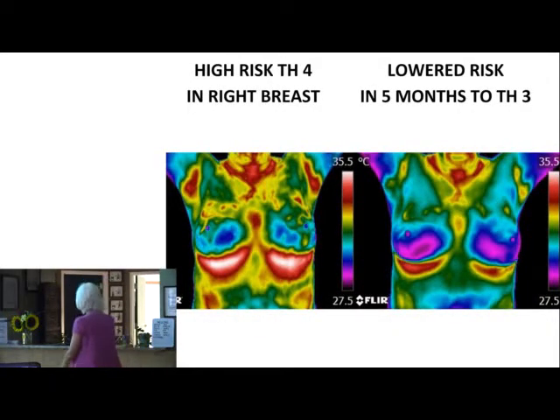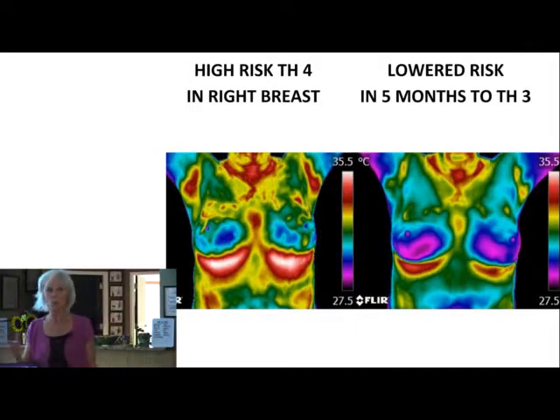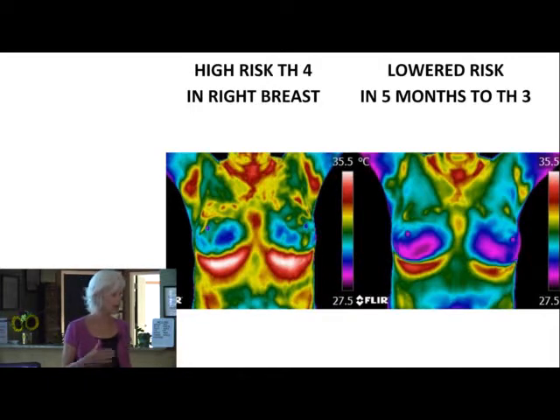Now we're going to start with some examples of before and after. If you give someone a risk assessment and you say that they are a 4 or 5, which is above average, okay, Gay, what do I do about it? All right, that's what obviously you're going to think, well, what do I do about it? So, as a health coach, I provide a follow-up session with every woman who comes to me after she does the imaging and the doctors do the interpretations, and we get a full detailed report about this with your risk assessment. Then I sit down with every one of my clients and we go over all the things they can do to make improvement. And a lot of it's dietary lifestyle, but now that I've imaged so many women, I know what women are doing now to affect positive change in this. I know what they're doing.